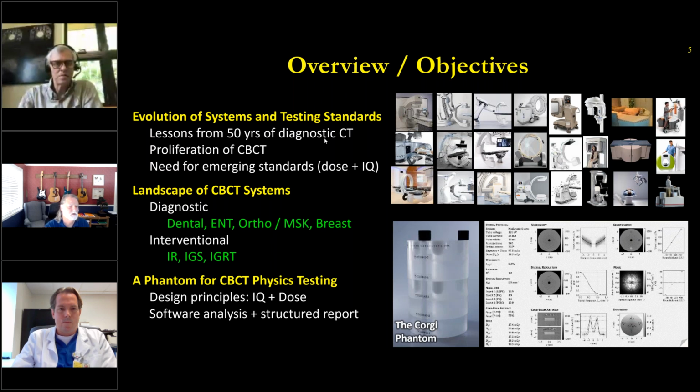And of course, over the last few years, we've seen the proliferation of cone beam CT systems for various dedicated applications. And I think the purpose really here is to develop and talk about the need for emerging standards for cone beam CT systems for both dose, radiation dose, and image quality.